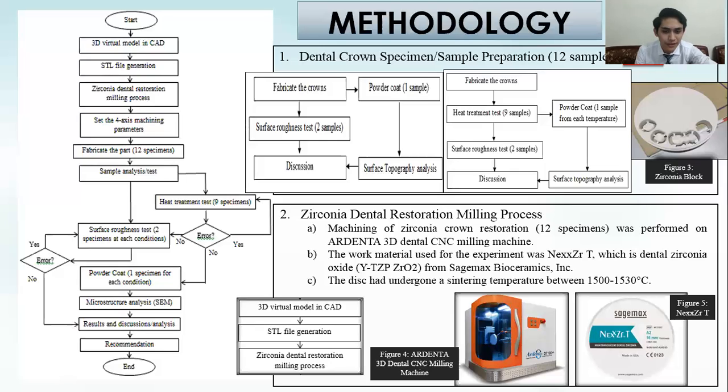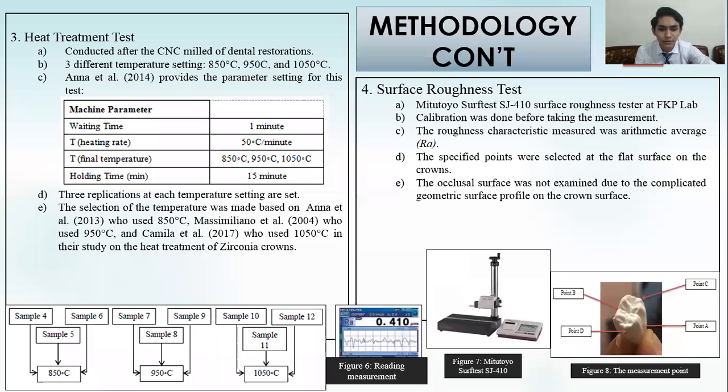So for your information, after we purchased these zirconia blocks, as shown in figure 5, Sagemax Bioceramics gave us a few samples of CAD files for crown and bridge restoration. So we just need to select one of the samples provided.